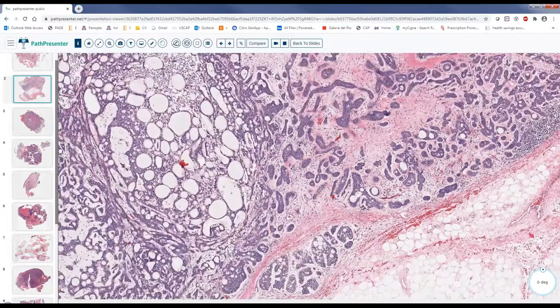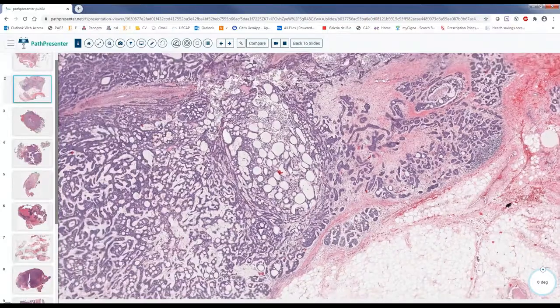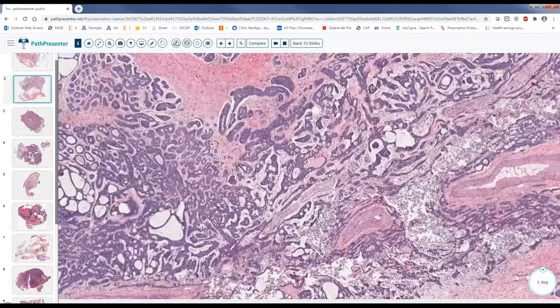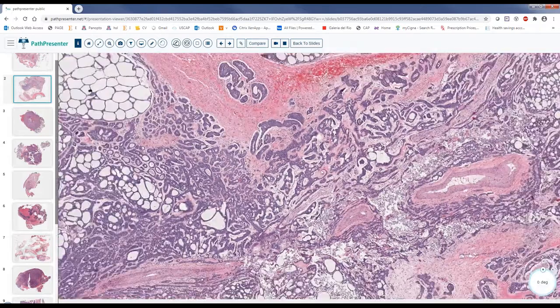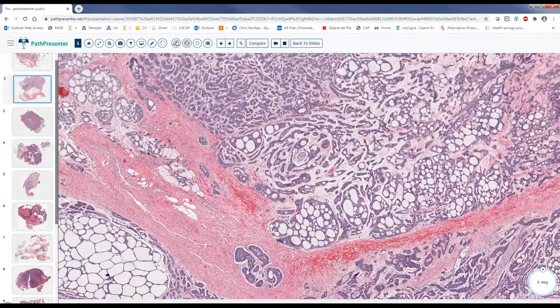And we know that adenoid cystic carcinoma can be in salivary gland, can be in breast, can be in any other areas. Okay, Dr. Tranesh is shooting us with the answers. We will go into that in one second, Dr. Tranesh. They are not really lumens.